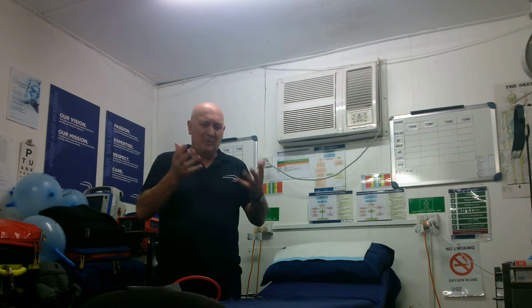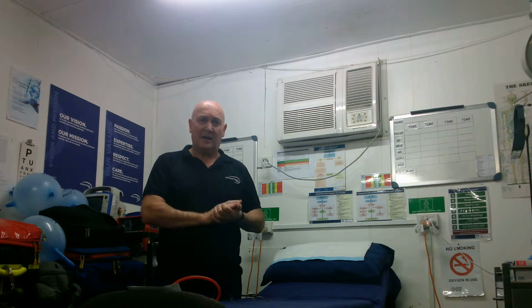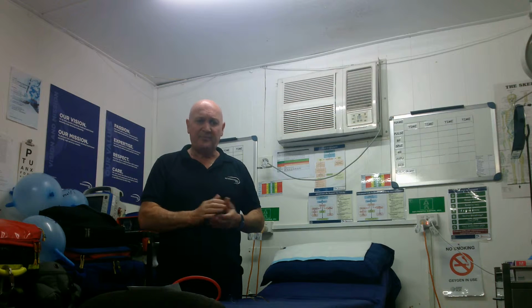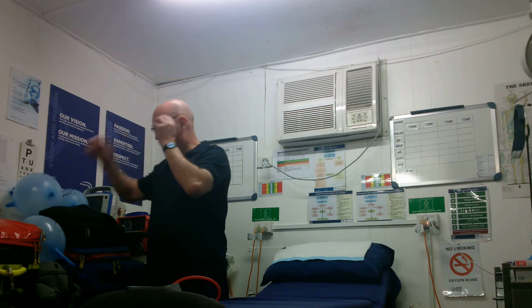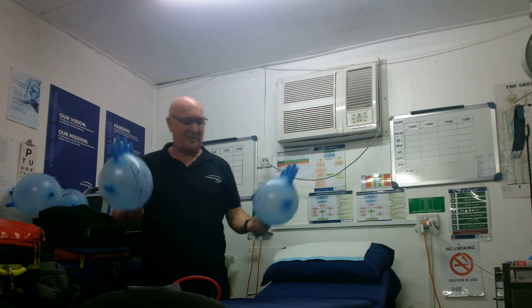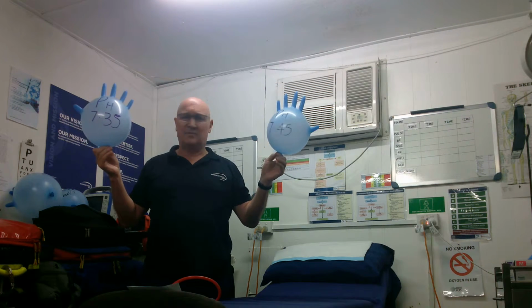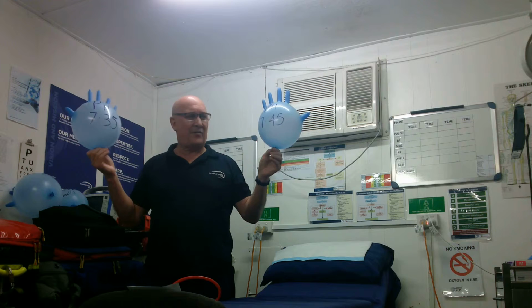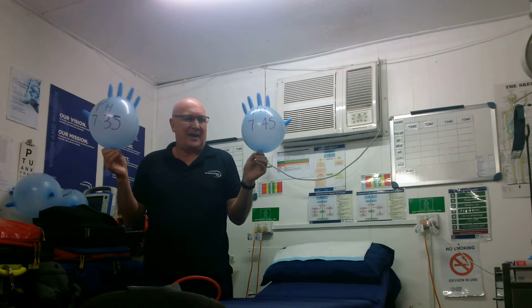So when we get the results from the machine, we've taken our blood, put it in our EPOC or our iStat machine, and it's printed out a small strip of paper that we analyse. So what we have to look at, obviously the patient first and how they present, and then we get some props. So what I've prepared is a few little props, and at the moment we've got to look at the pH. So I'm between 7.35 and 7.45 at the moment. That's my normal pH. I'm operating at that right now.